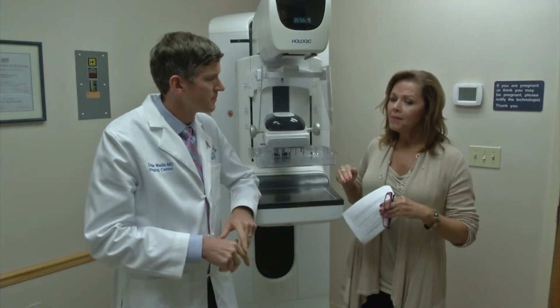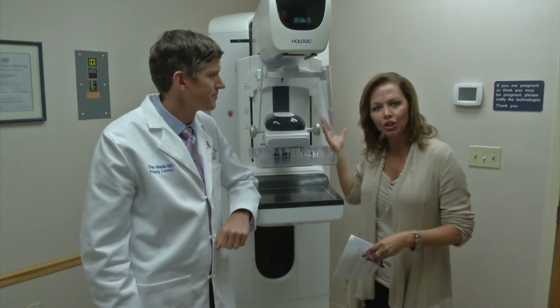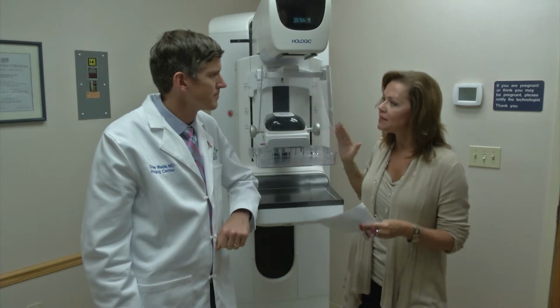Absolutely. With the 3D mammography, and we're standing right in front of the machine here that you see on screen, and you may be able to hear it in the background because the machine is actually on, what about radiation? Is there a concern with radiation? The benefits far outweigh the downside of the radiation. Yes, there is radiation, as there is with any technology that uses x-rays, but there are national standards that we're required to adhere to, and even as we add just a little bit more radiation with the tomosynthesis images, we still are well below that threshold. If you look at the actual risk to a patient of applying that radiation, it is much less than the benefit we get in increased longevity for women in whom we detect breast cancers.